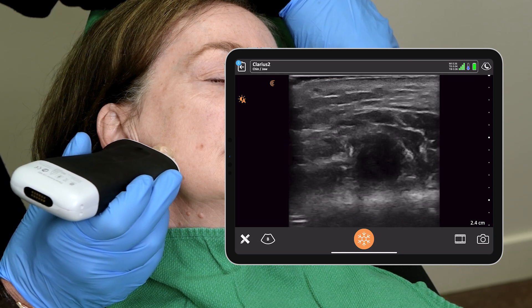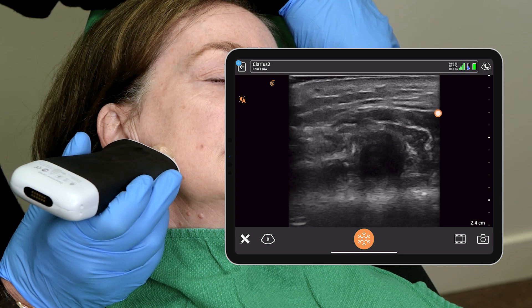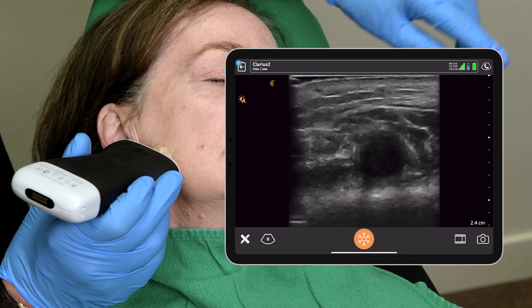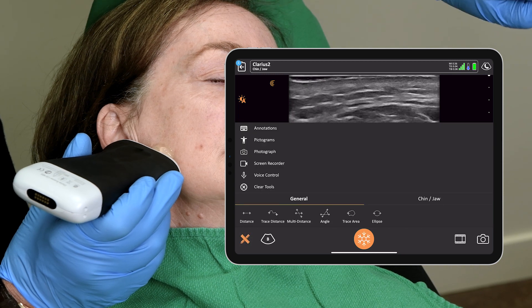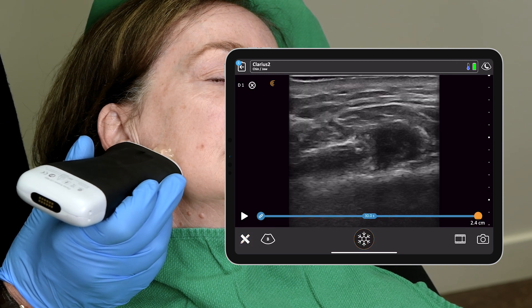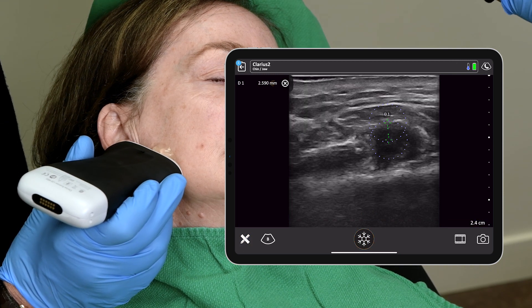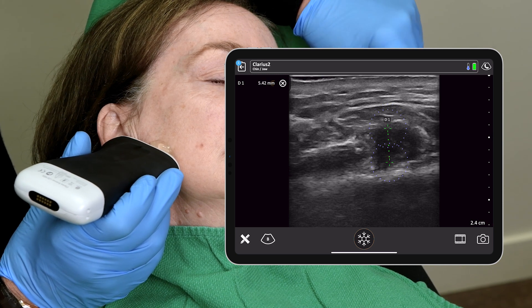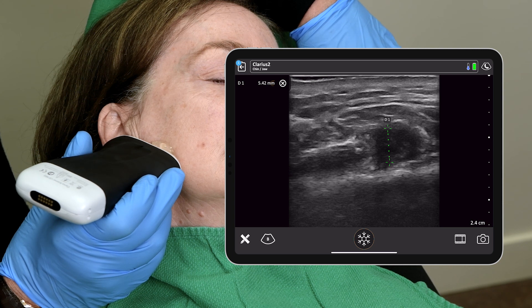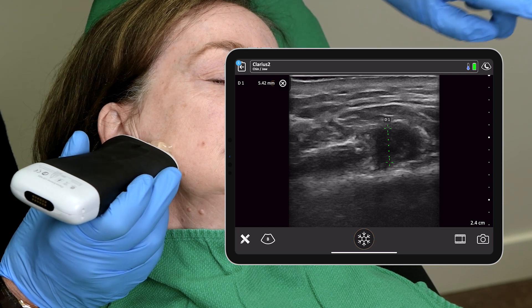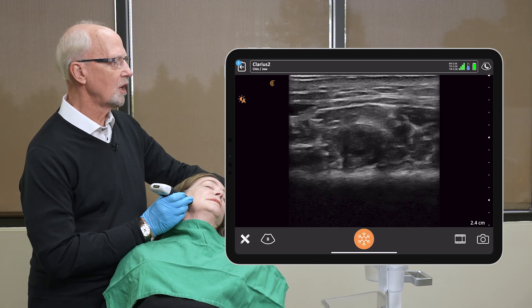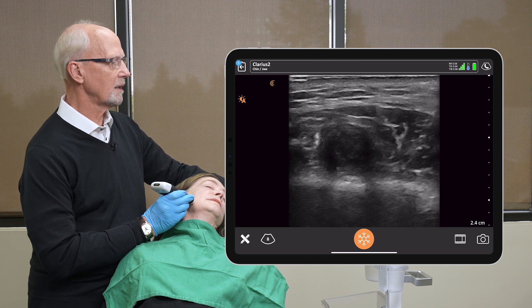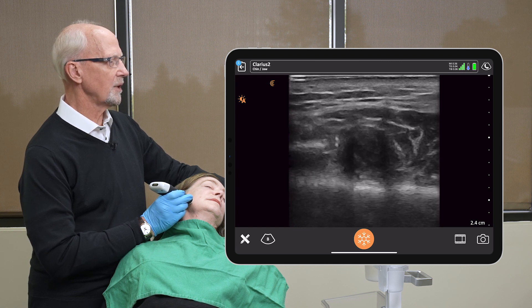You can see the fascia around the masseter. We can see that this is relatively superficial and what we'll be doing is we'll go right into this. We know that the size of this area that we'll be aiming for is about 5.4 millimeters in thickness. We can see it's well localized.